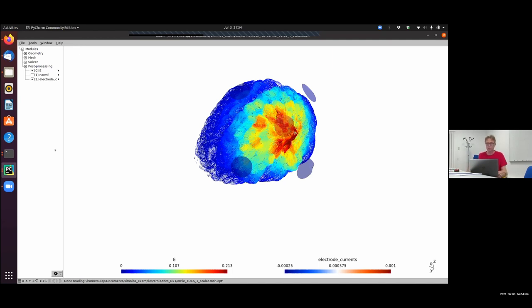So I guess we have to distinguish between simulation of brain stimulation and generally simulation of brain function. In terms of simulation of brain stimulation, there's also the ROAST toolbox available from the Parra group, which can only do electric stimulation. Apart from that, there are also commercial tools available, but I think these are the two main free tools which you could use, either SimNIBS or ROAST for electric stimulation.